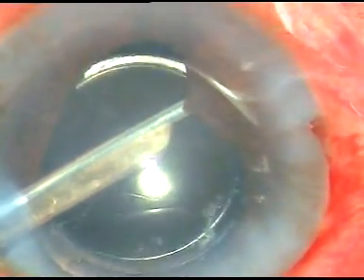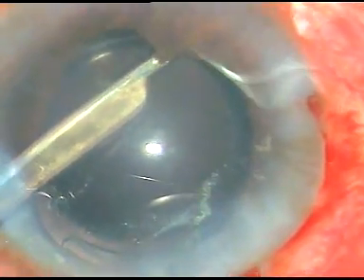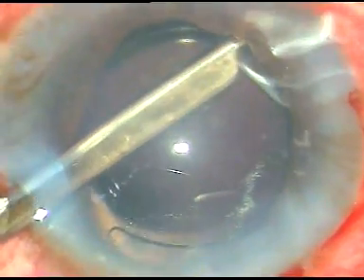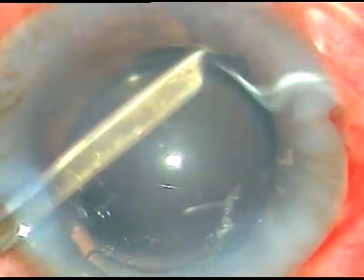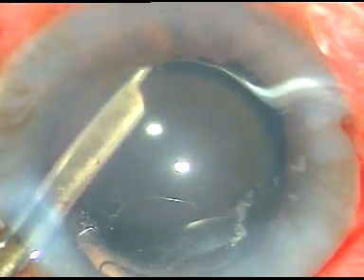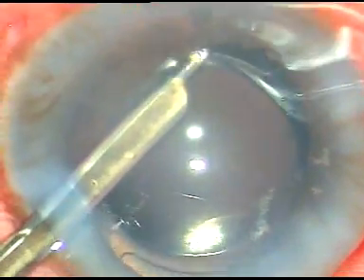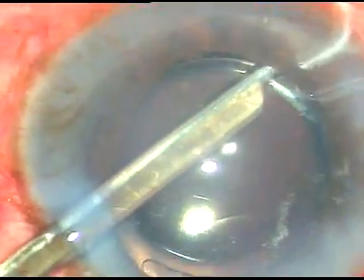Now I am pulling the iris. I am holding the pupillary margin with vacuum and pulling it a little bit so that the block at the angle is gone.